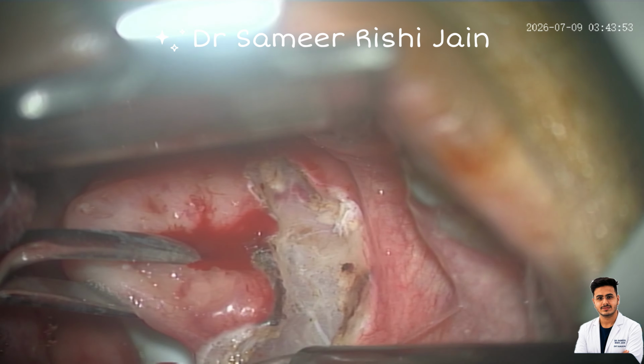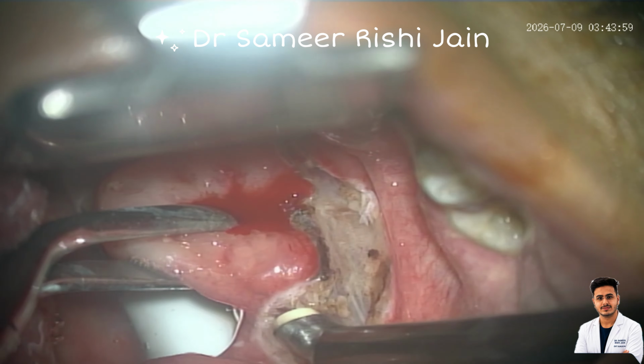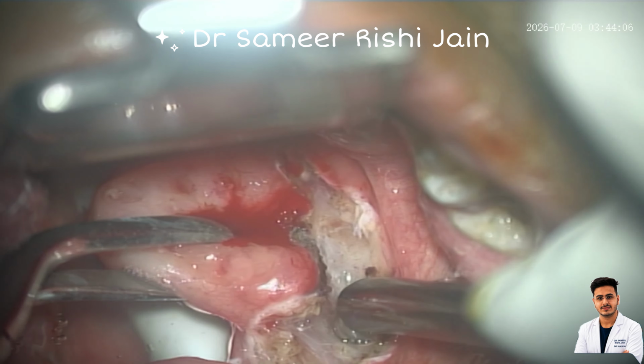The pain in the tonsillectomy is due to the exposure of the muscle fibers or the myositis. So if we prevent the opening up of the fascia or the exposure of the muscles, it will be a purely painless surgery.